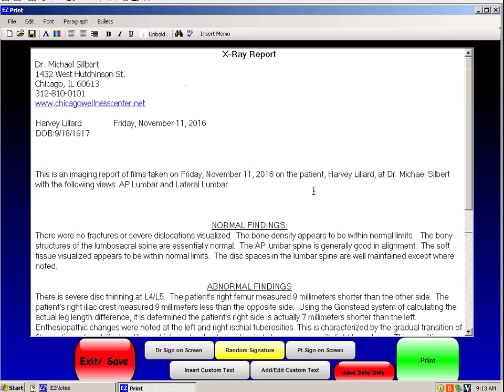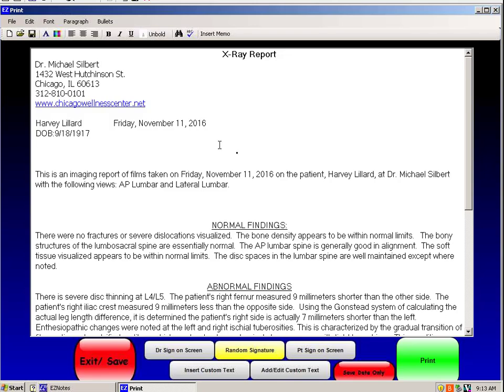At this point, it's going to generate very quickly an x-ray report. Again, with my clinical information, the patient, the date of birth, the date of service.